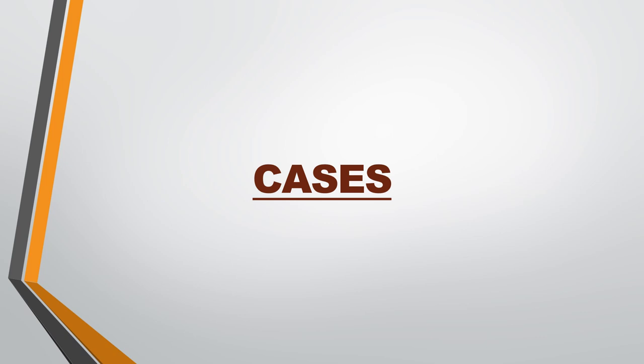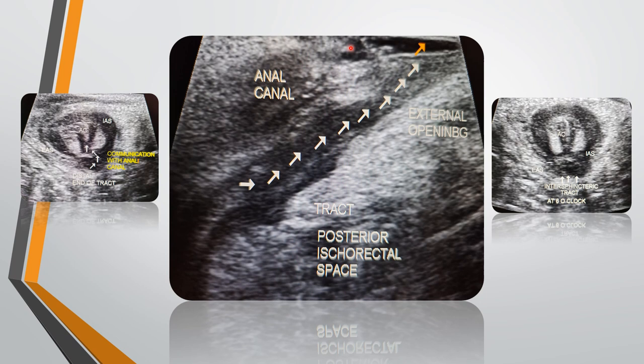Now we come to the cases. In the first case, the linear probe was kept on the anal opening. The sagittal image shows the anal canal with a single linear non-branching tract arising from the anal canal, extending downwards and opening into the external opening site. There is no evidence of any abscess, collection, or branching adjacent to this tract.